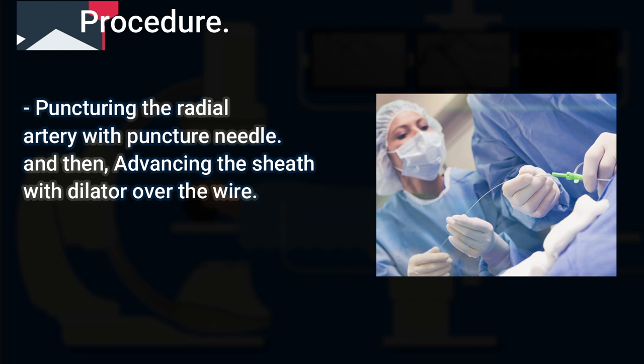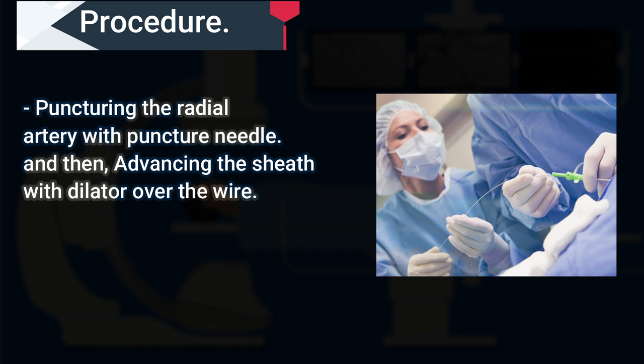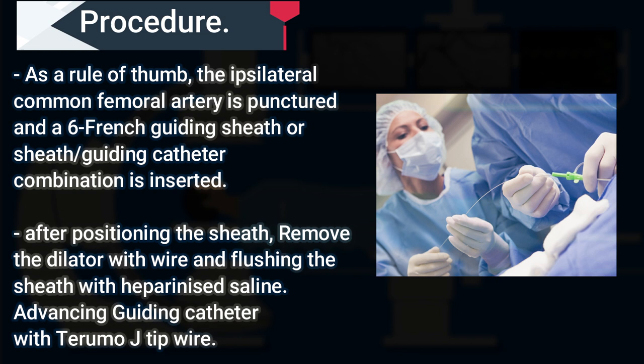The renal artery angioplasty procedure begins with puncturing the radial artery with a puncture needle, and then advancing the sheath with dilator over the wire. After positioning the sheath, removing the dilator with wire and flushing the sheath with heparinized saline.